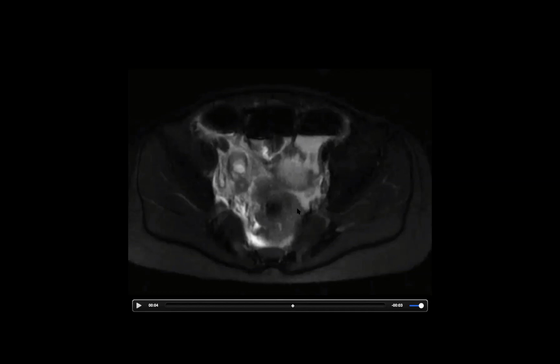Chemical shift. Yeah, absolutely. So there's really just a shift in the fat relative to the water in these images, right? And so it's just manifesting here, and you see it pretty clearly.